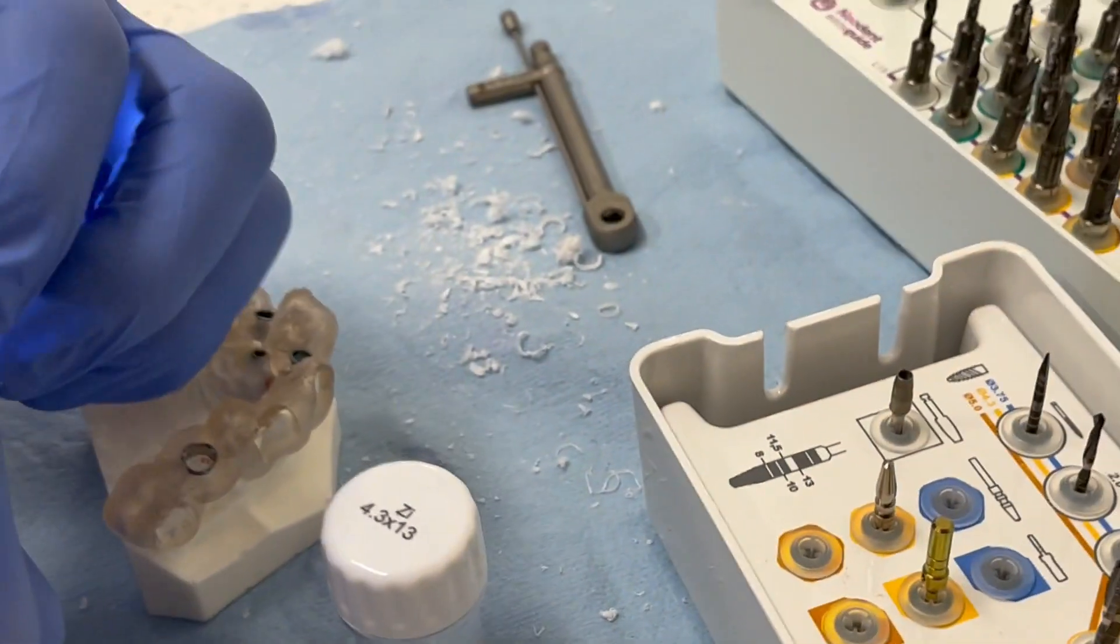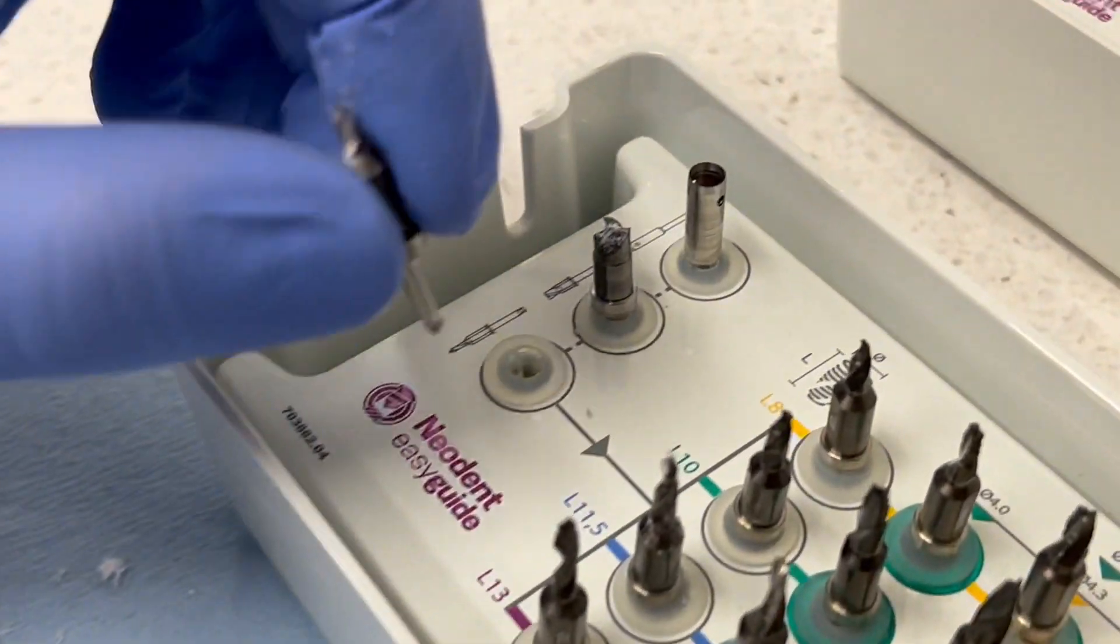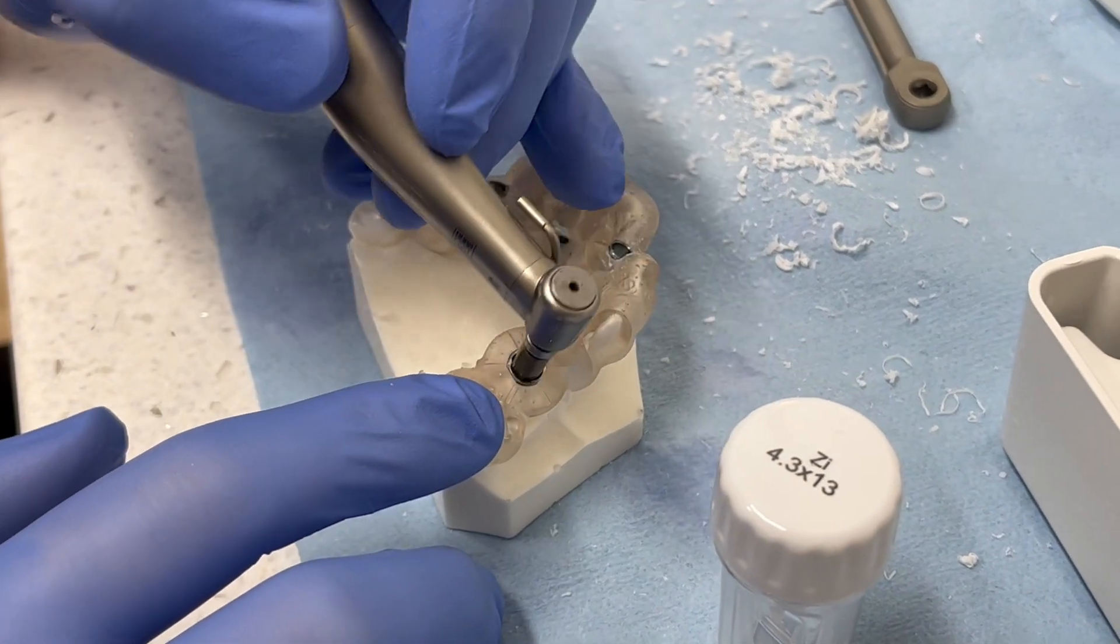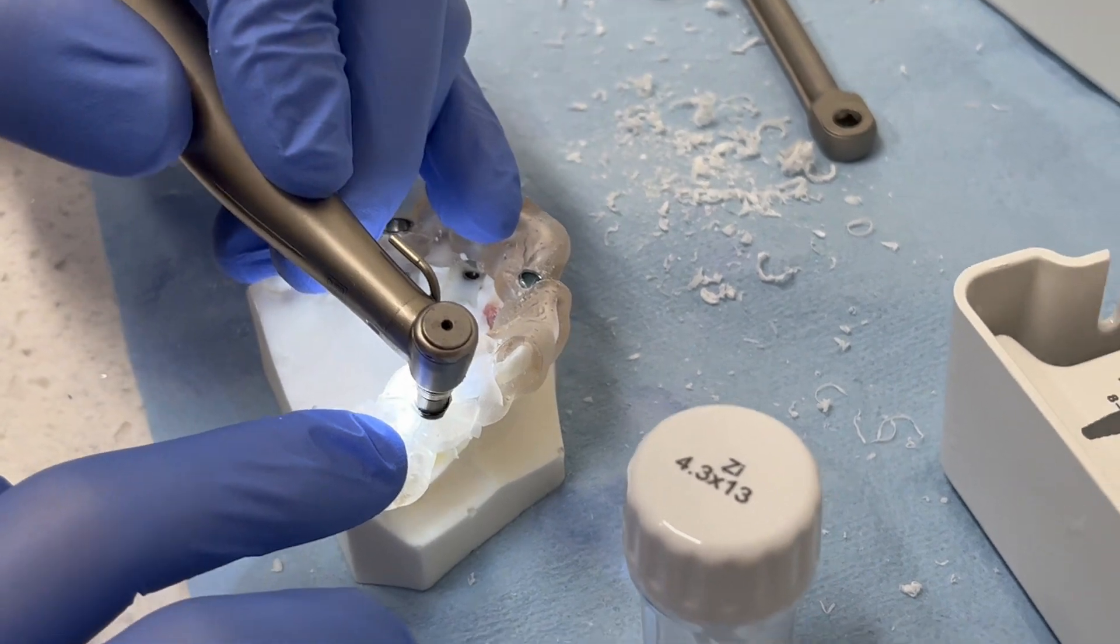And now we have room for our next drill, our little 6-0 kind of starter drill, to have room for the cylinder to slide down and engage into that bone.